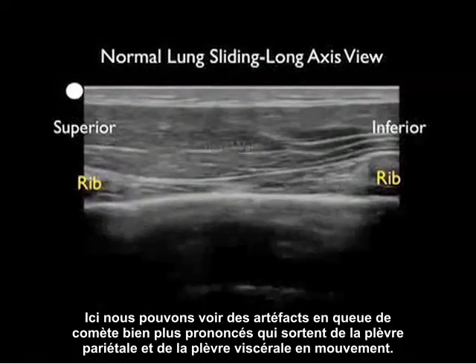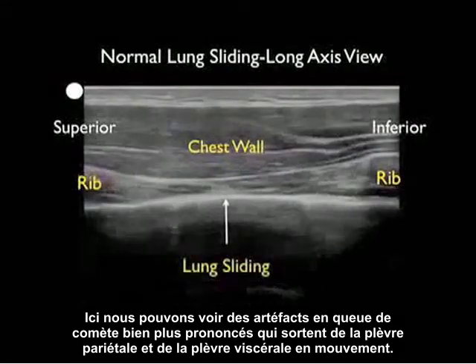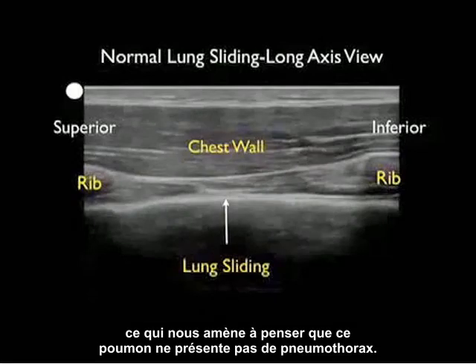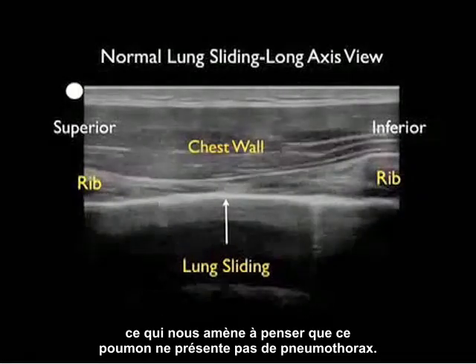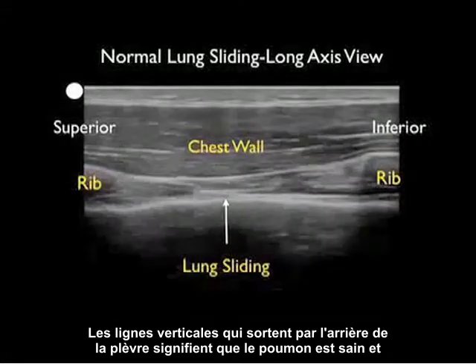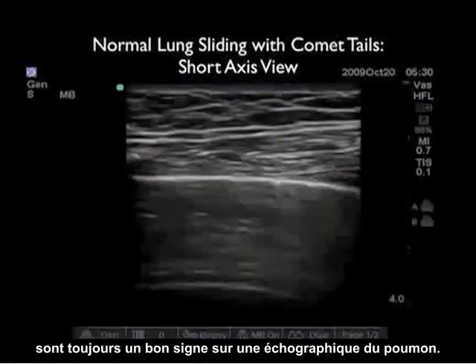Here we see more dramatic comet tails coming off the shimmering parietal and visceral pleura. In this patient, we see the comet tail shooting off the back, telling us that this lung is up and there's no pneumothorax. Vertical lines coming off the back of the pleura always mean that the lung is up, and are always a good sign on lung ultrasonography.